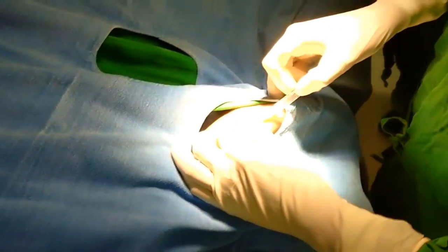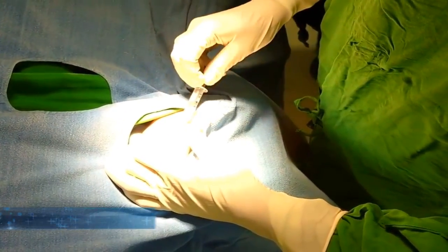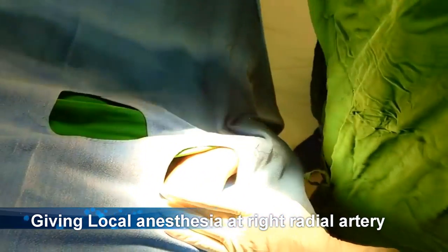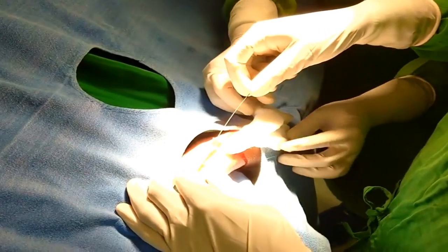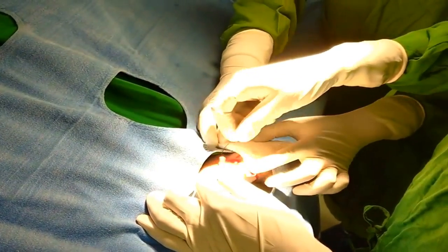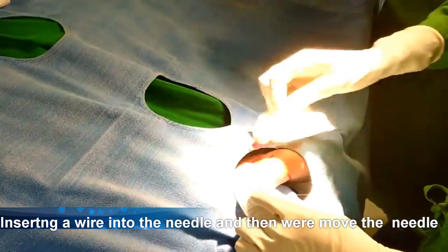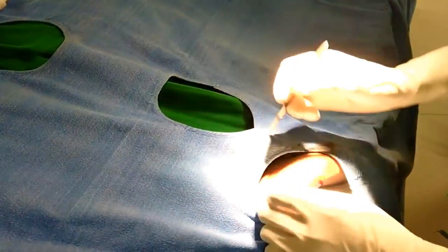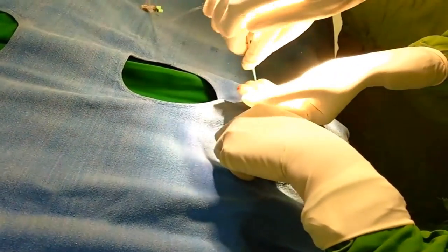This is live angiography video. We are giving 1 cc local anesthesia at right radial, just above 1 inch of the right wrist joint. We are cannulating with a needle, through which we are passing one wire. After passing the wire, we remove the needle cannula, then make a skin nick at the wire level.